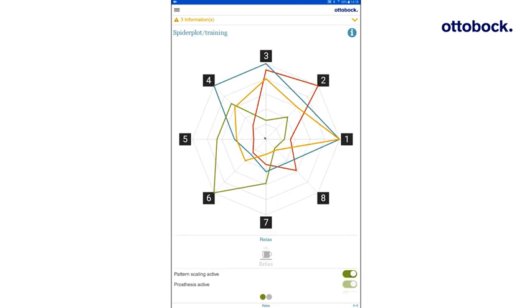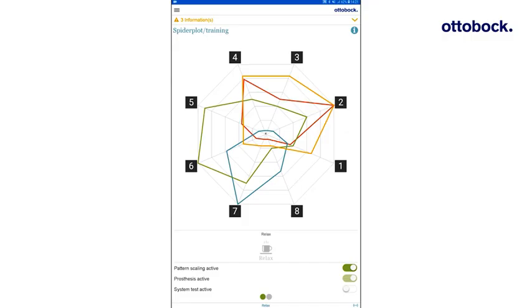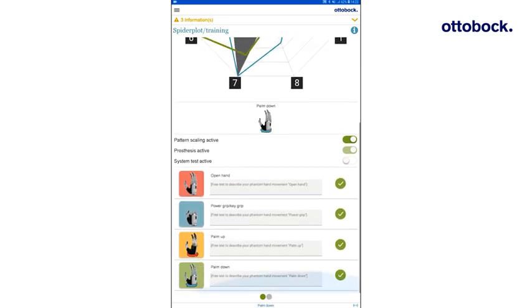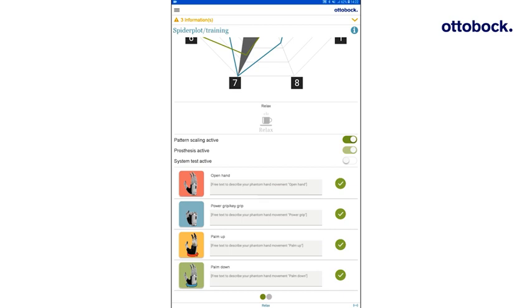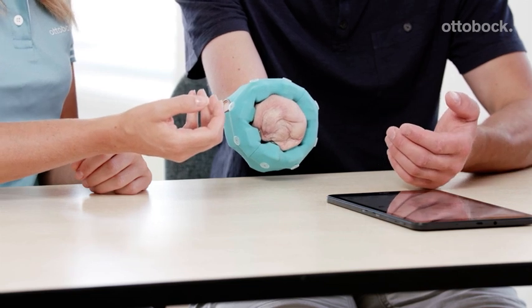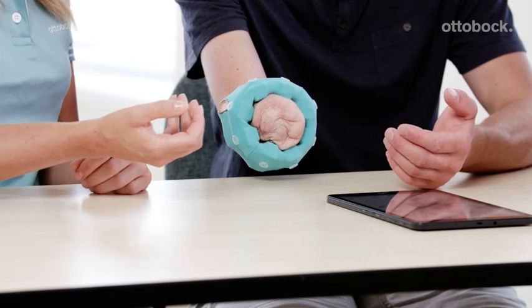The user can now test the reliability of the control in real time by displaying the spider plot or movement display. The spider plot now displays the patterns of the test set in different colors. Each colored pattern controls a prosthesis movement. The red pattern corresponds to hand open. The blue pattern to power grip or key grip, depending on the thumb position of the bionic hand. The orange pattern to palm up. And the green pattern to palm down. Now, let the user reproduce the phantom hand movements.